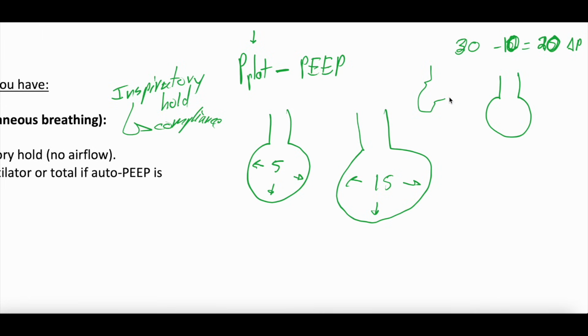I think this alveolus is kind of collapsed down. So what I'm saying is, I think if I go up on the PEEP, that will cause the alveolus to be perfectly distended, which means that the plateau pressure won't really change because I'm just going from an under-distended, shriveled down alveolus to a normally distended alveolus.